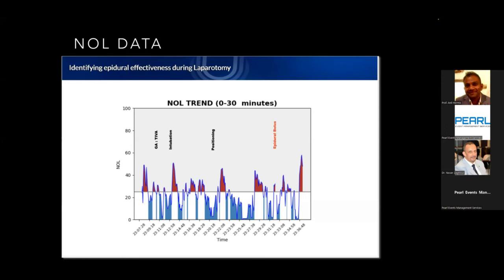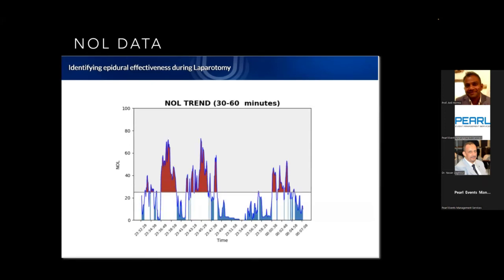I gave her an epidural bolus before the surgeon started at this point, 11:30. And this is where knife to skin was. So again, you can see that there's a huge response once the surgeon started operating. And again, this is just because the epidural doesn't have time to start working. So at this point, I increased the remifentanil and I got it to a nice dose.